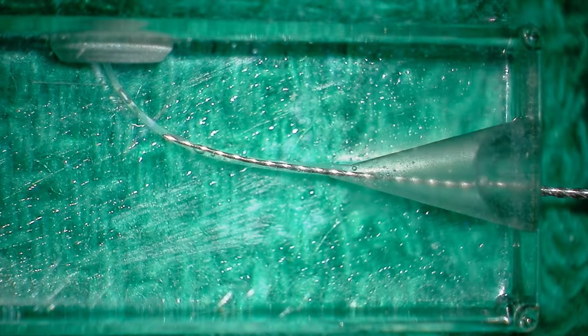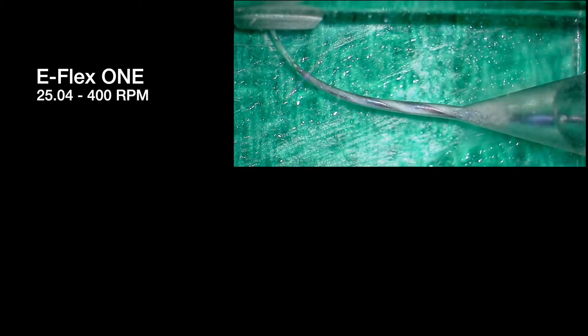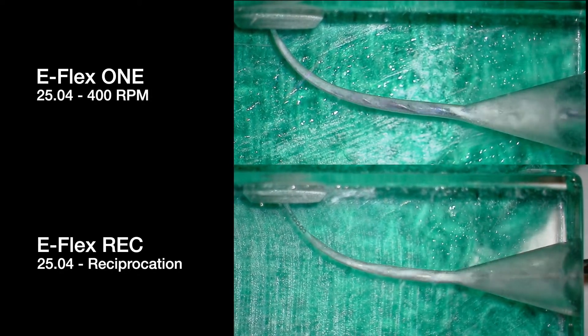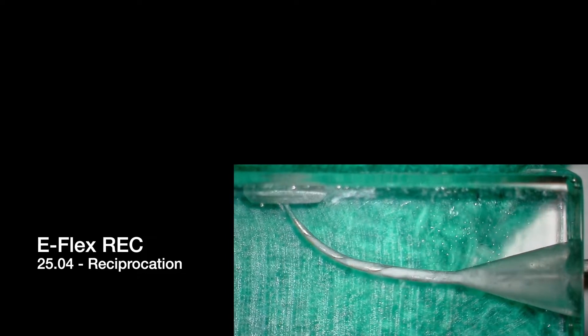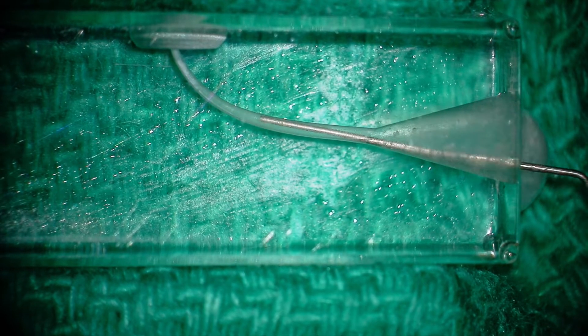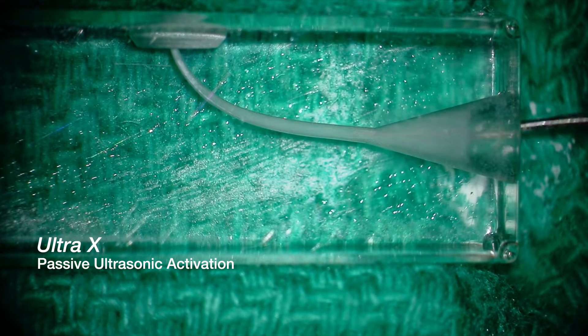For all files I'll make sure I have a reproducible glide path with a number 10 hand file, and then the journey begins. Both the E-Flex 1 and REC are designed as a single file system — the 1 is a rotary file and the REC file is a reciprocating file. Continual irrigation is critical to the success of your root canal treatment, and activating your irrigation with the Ultra X aids to break down vital tissue and biofilm.